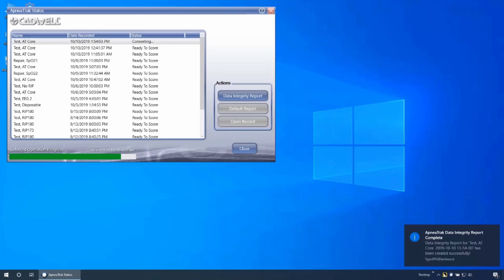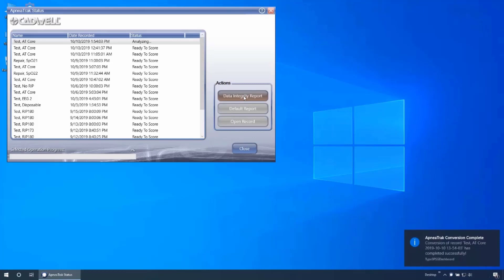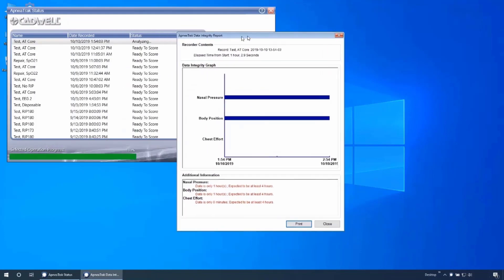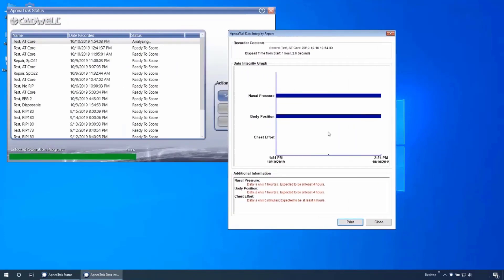During the process, the Data Integrity Report button will activate. Clicking this button will open the Data Integrity Report window, getting a summary of the amount of data present during the recording.